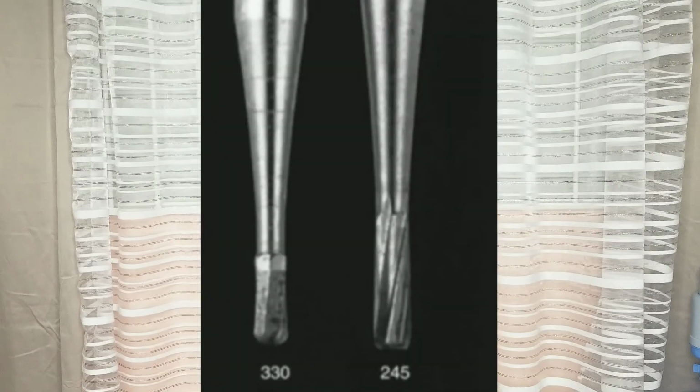You're going to need burs. I'll have to insert pictures of the burs because they are extremely small. So even if I hold them up, you won't necessarily see what I'm talking about. So this is like a bur. This is how small a bur is. So you probably won't be able to see it, I'm not sure. But this is a 330 bur, which you use basically almost all the time. When you're starting out, you're definitely going to be using 330 and 245 burs. I know this probably won't make any sense to you until you start dental school, but it's just to guide you. Those are used for the cutting of your cavity preparations.